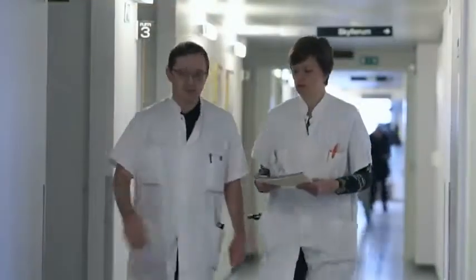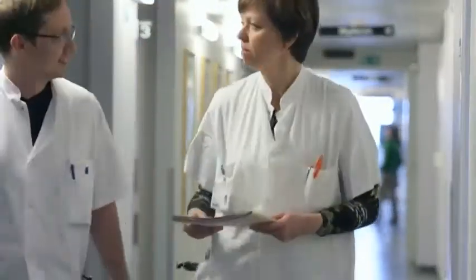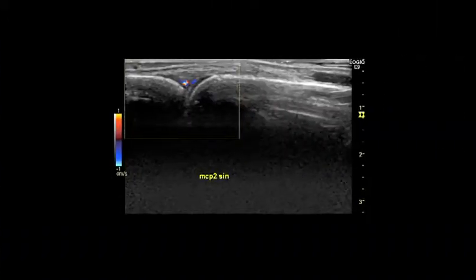joints. Quite recently, we saw a patient who had a lot of clinical symptoms indicating arthritis, but did not have any signs of swollen joints and had never experienced swollen joints. And yet, when we did the ultrasound, he actually had Doppler activity bilaterally, covering nearly all of the fat pads in the 5 MCP joints. That was a very important finding.